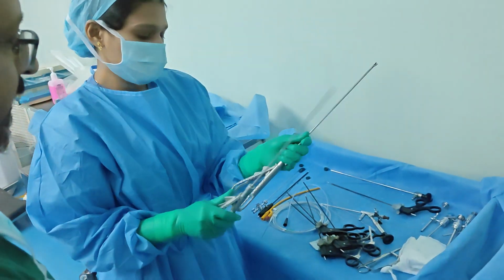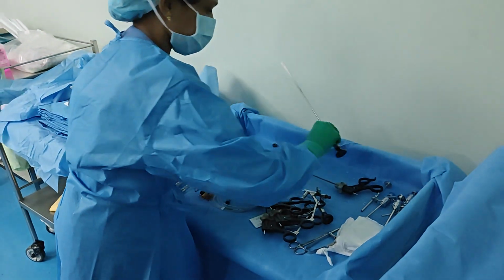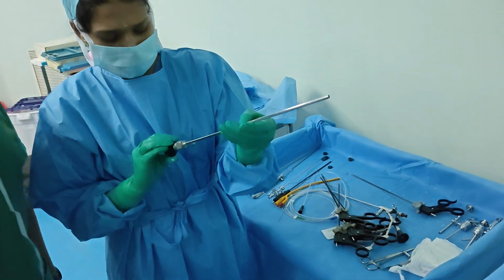Okay, that's fine. Now show me that 5 mm telescope. What is it, 0 or 30? 0 degree. So what do we normally use?